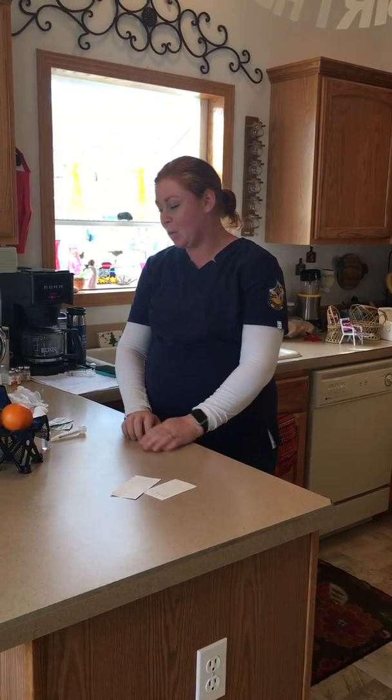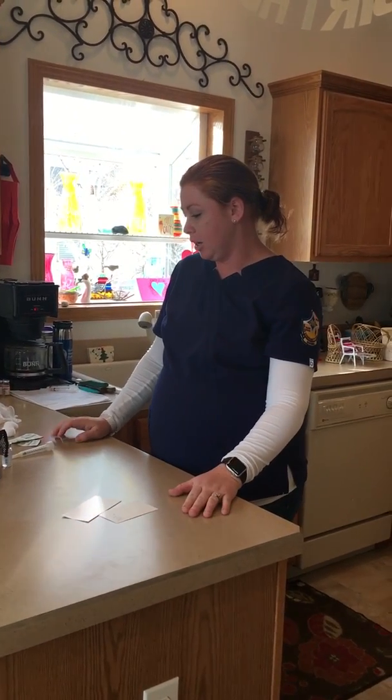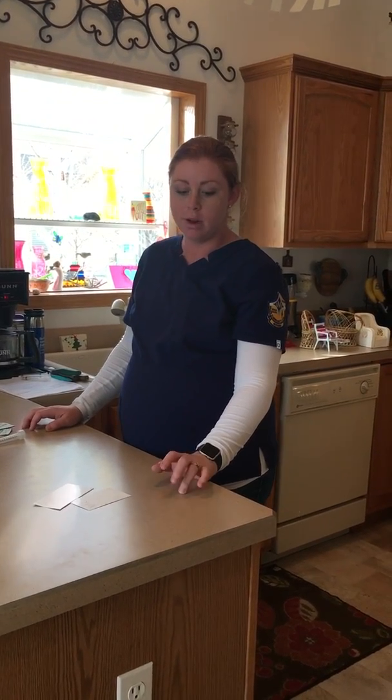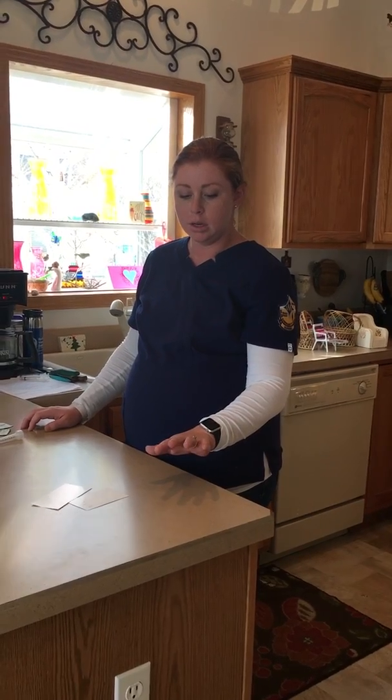Okay, we're going to be doing a TB test today. For this, I'm going to administer this test using the 6 medication rights: right patient, right dose, right route, right medication, and then right time and right documentation.